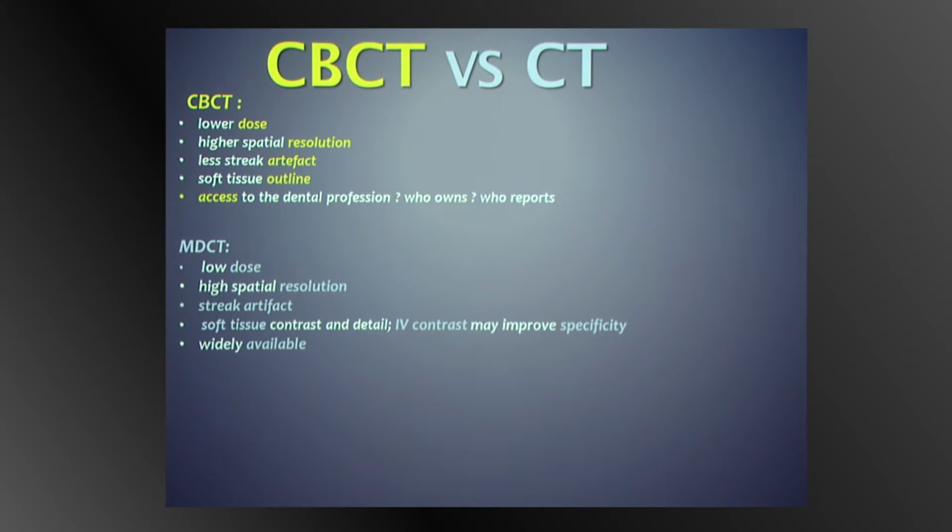Cone beam is tightly controlled in certain states anyway, and the laws pertaining to who can use it vary from state to state. In WA, you have to be a radiologist, and a radiographer has to run a cone beam unit. It cannot be run by a radiographer on its own or a clinician. So it does vary from state to state.